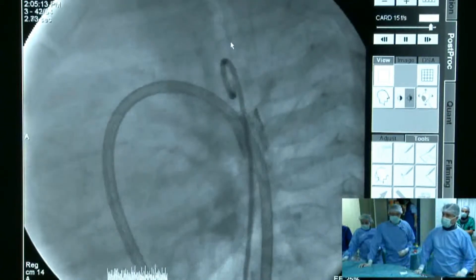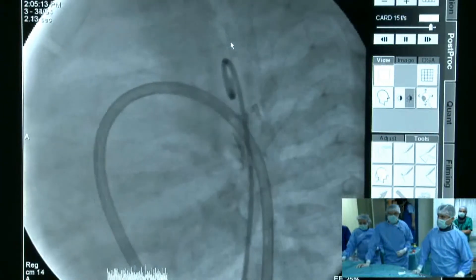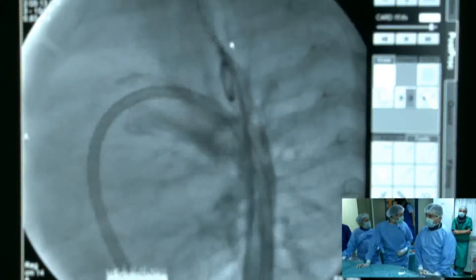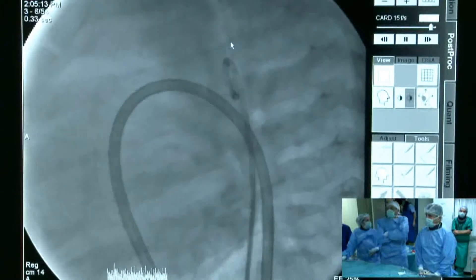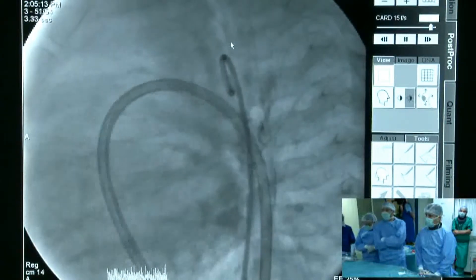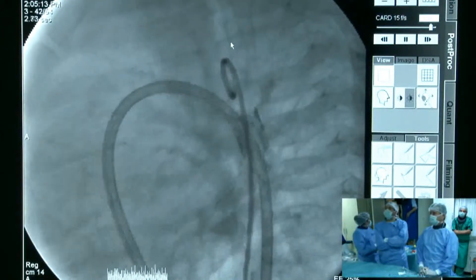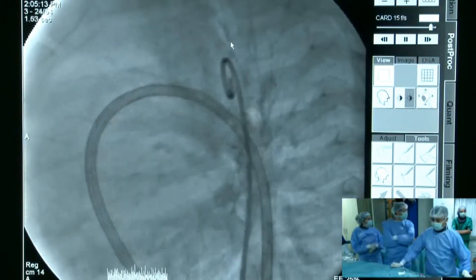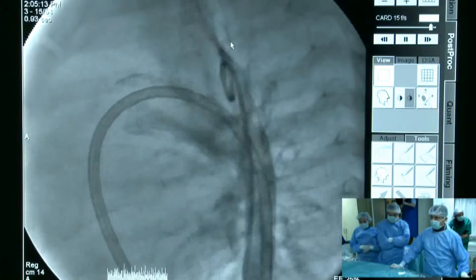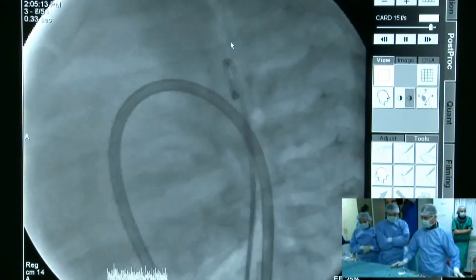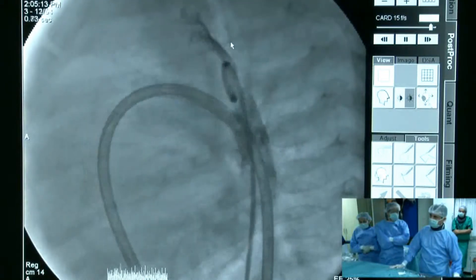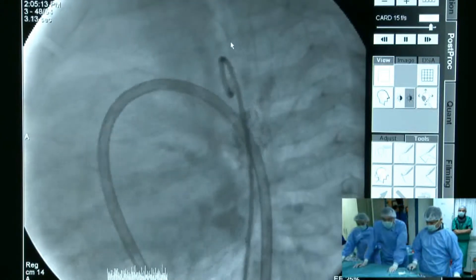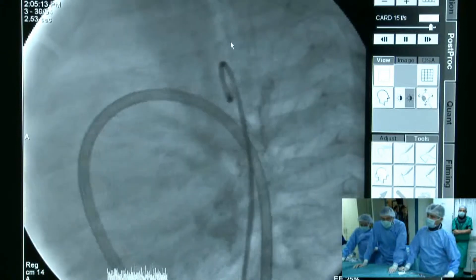What is your plan? Our plan is to occlude with a cocoon device, 4 to 6 mm — that is the ADO1 6-4. Do you think it is large enough? We could choose 8 to 6, but the patient's ampulla is about 6 mm, so we want to avoid protrusion. We feel good with the 6-4 device.